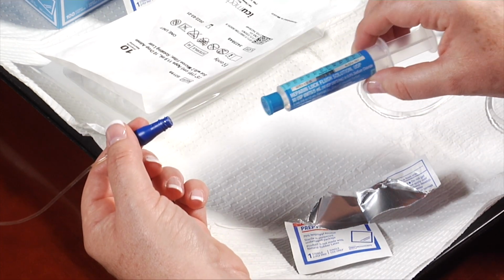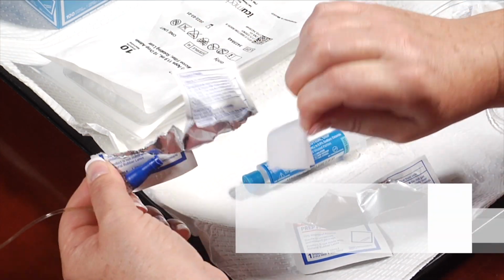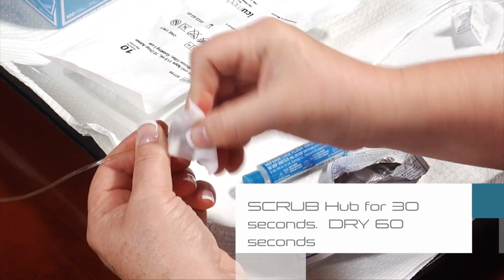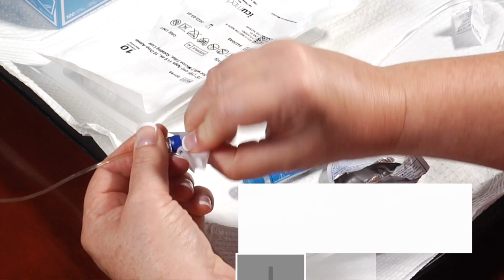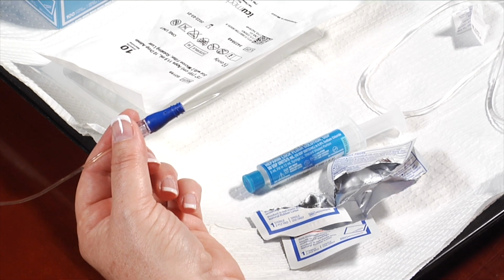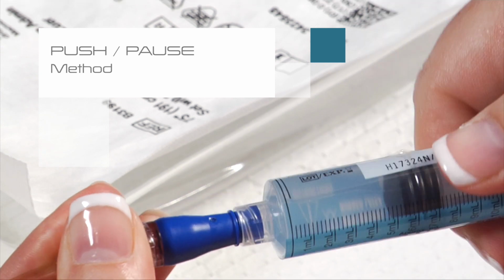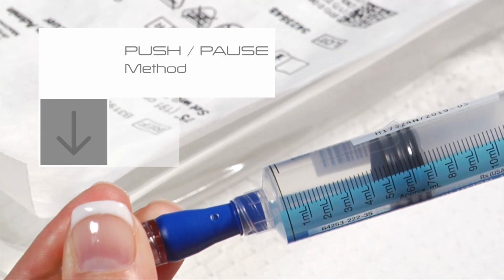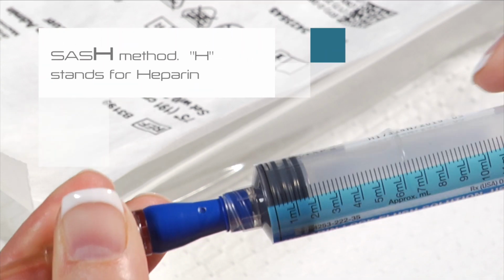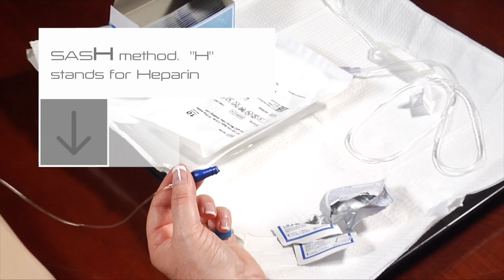If your catheter requires the use of heparin, scrub the hub of your injection cap again with a new antiseptic wipe for 30 seconds, and allow to dry for 60 seconds. Attach the pre-filled heparin syringe to your injection cap and flush the IV catheter with contents. SASH method. H stands for heparin. Disconnect the heparin syringe.